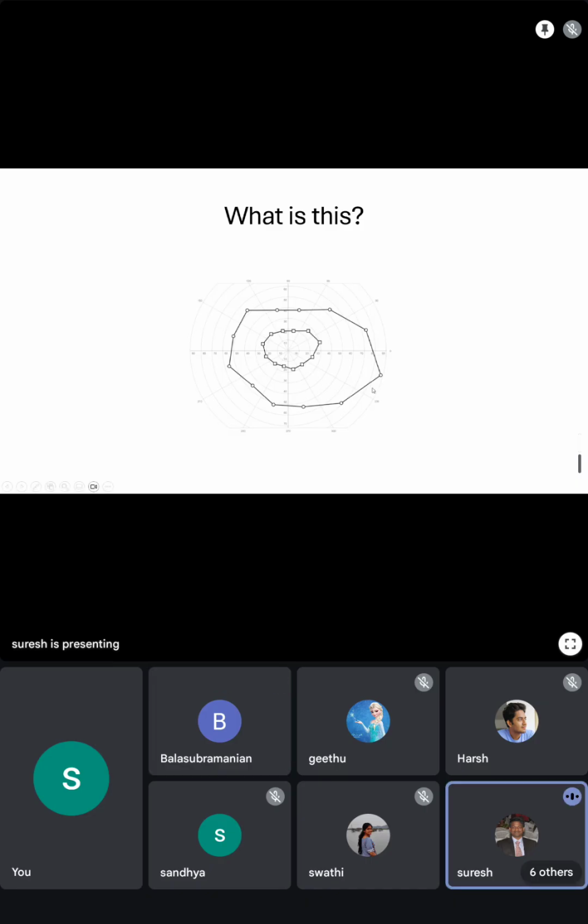See, kinetic perimetry, the newer Humphrey perimeters allow us to do even kinetic perimetry, and this is a printout of a kinetic perimetry done with a Humphrey. Okay. So in future, if someone asks, can you do a kinetic perimetry with Humphrey? Yes, it is possible. We must not say no, it is a static perimeter.